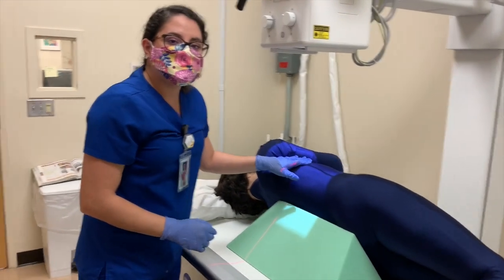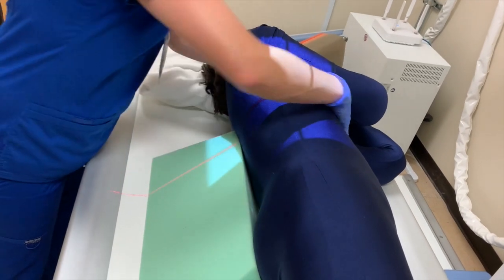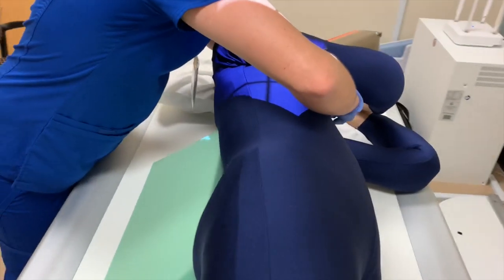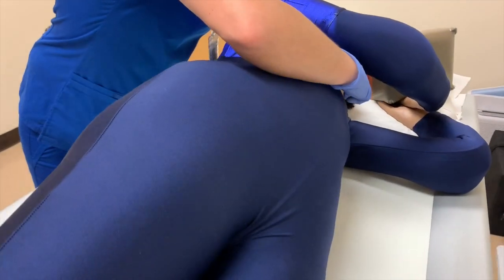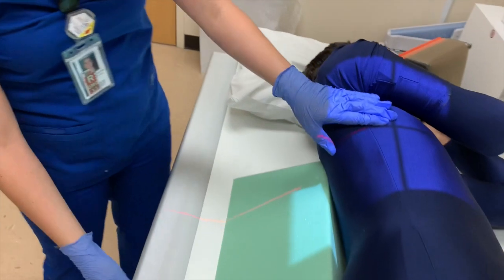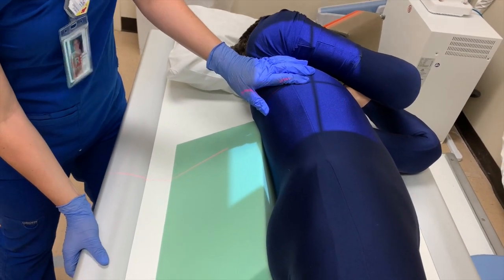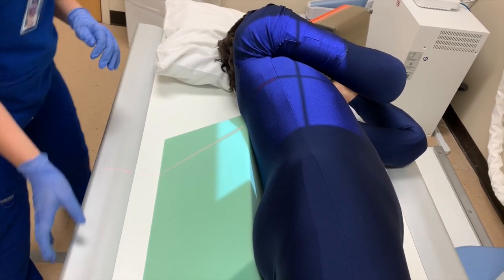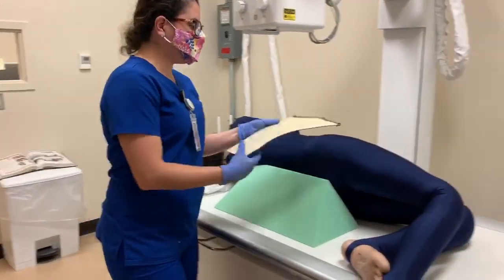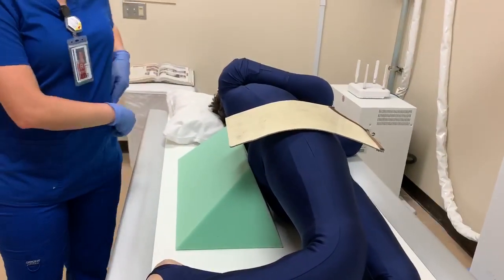And our CR is going to be 4 inches below the jugular notch at T7. So I'm going to measure 1, 2, 3, 4. I'm slightly above, so I'm just going to move her down just a little. We're going to use a shield to shield any tissue that does not need to be exposed.